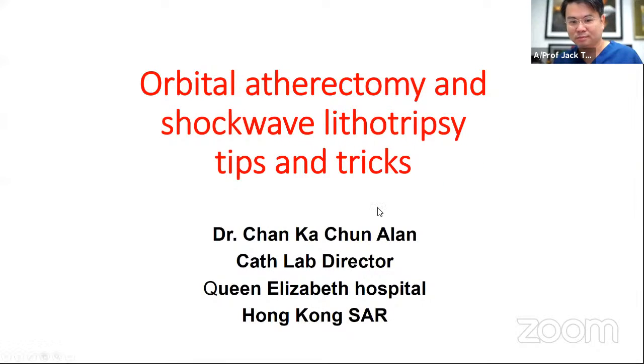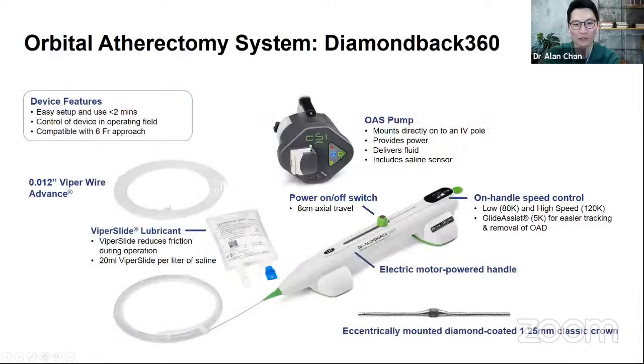Okay, I can share my slides. So thank you very much for inviting me to be part of this event. It's a very challenging scenario, because just 10 minutes to cover this huge topic. I think we can talk about this topic for more than 1 hour. So I will keep it simple. My 10 minutes will be divided into 2 parts, basically more case presentation. First of all is orbital atherectomy.